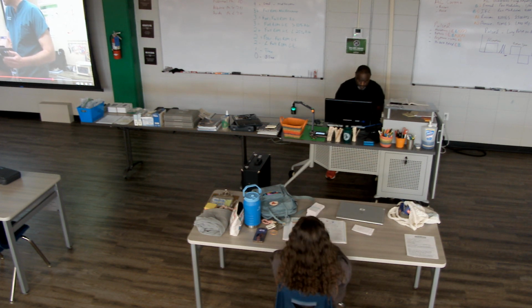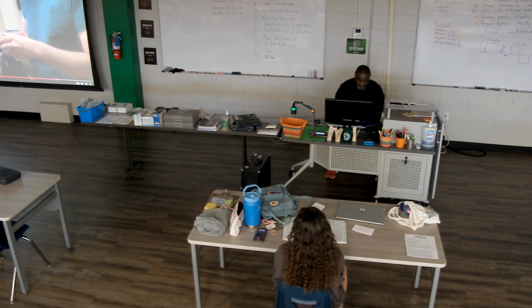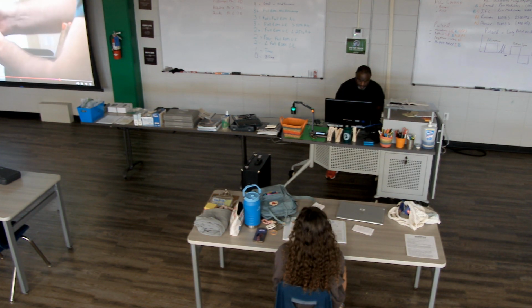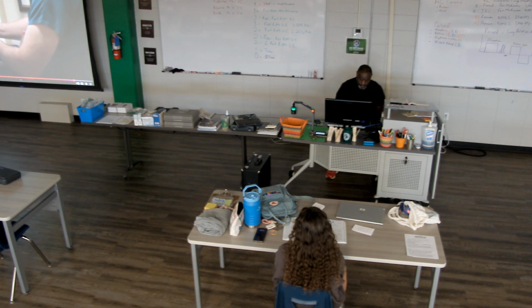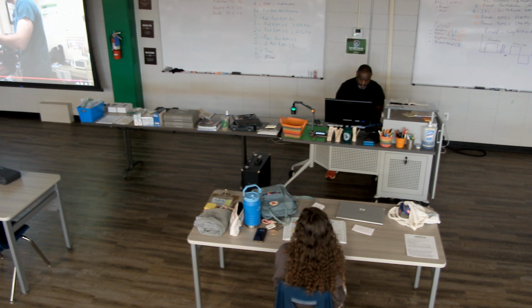It's fairly simple. You turn it on, just like we have it right here. We push the button on, and it should go on in just a few seconds. I have the little hourglass going right now. And now we have it working. She will wear it for approximately 45 to 50 minutes.